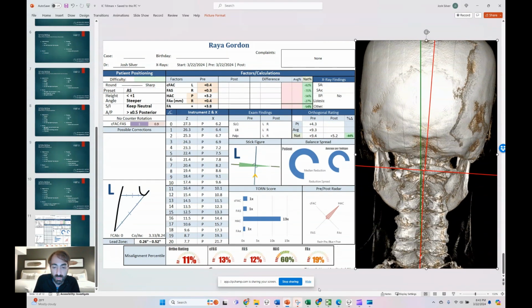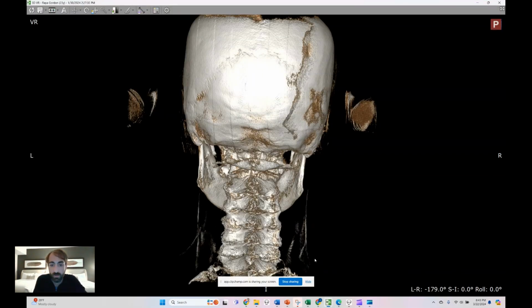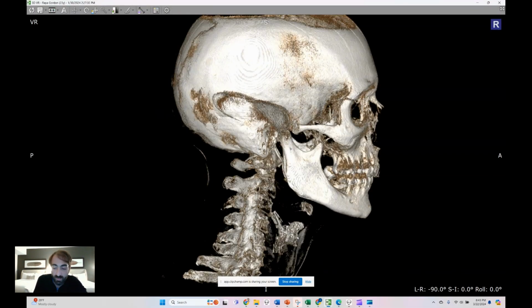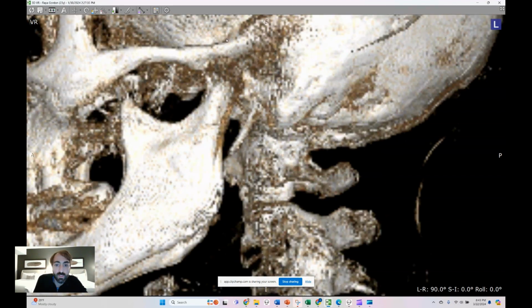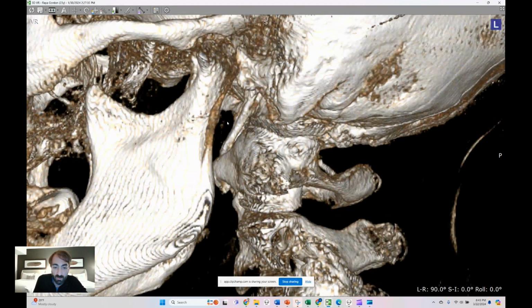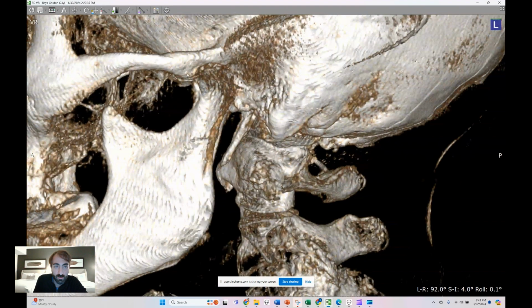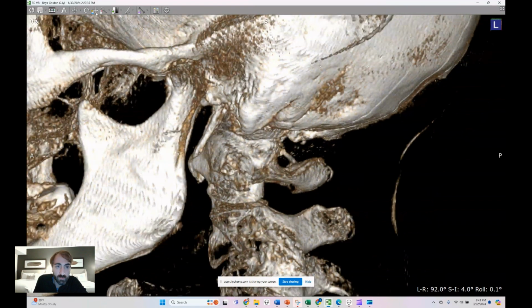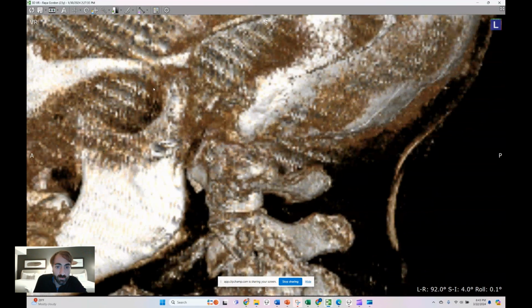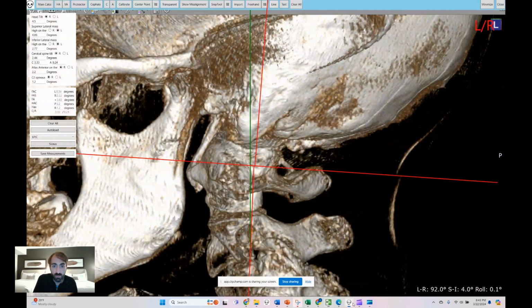And then we need a left TP. So let's go ahead and get our TP shot. It's on the left, so we'll take it like this. Zoom in on that TP. Take out some of that head tilt. Match up the jaw lines. Shading right. That is what I want to see there.